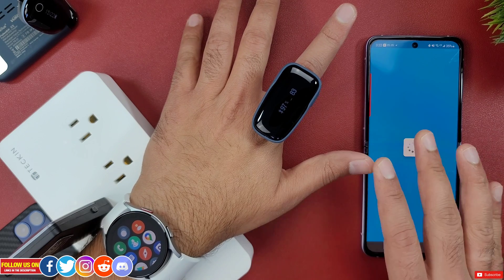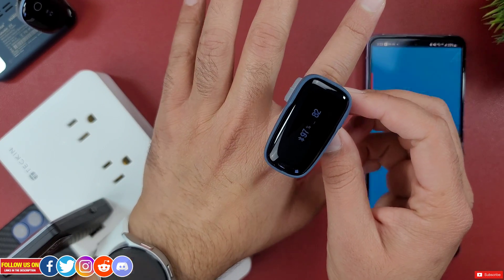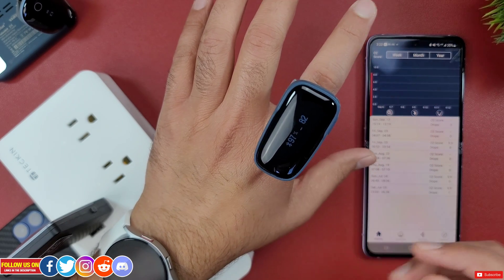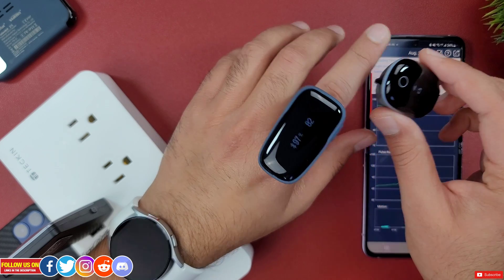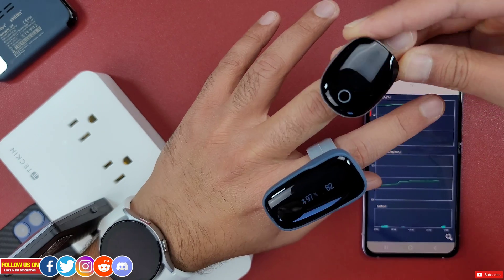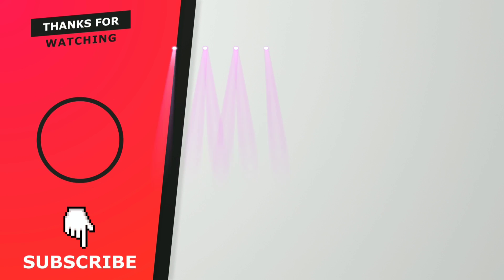The only caveat is that the device is a bit bulky and takes a few nights to get used to. The O2 Ring is more comfortable to wear without even noticing it on your finger, but as explained they serve different purposes and hence the cost is also different. Thanks so much for watching — check out these cool health trackers from Viatom as you may find them helpful.